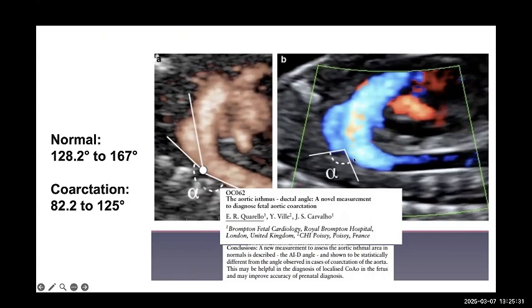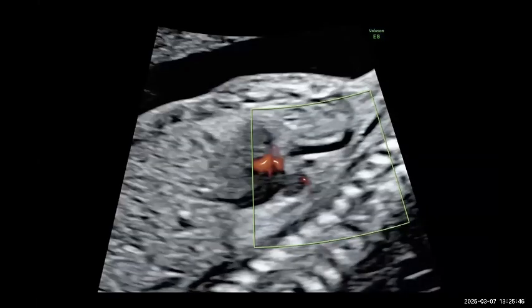Not all of these findings are always present in every patient. Some patients present only with hypoplasia, some only with disproportion, no posterior shelf, normal Doppler. That's where the challenge begins, and where the patient needs to be stratified. The risk of coarctation may not be high, and prostaglandin is not started, but rather postnatal assessment in the first day or first hours of life.